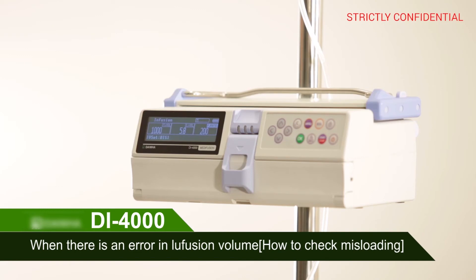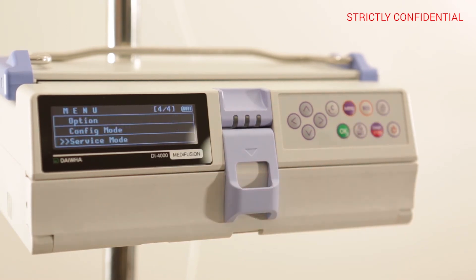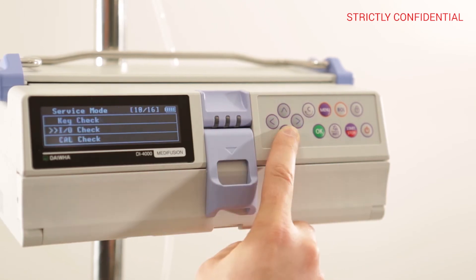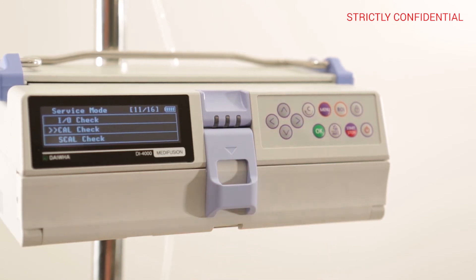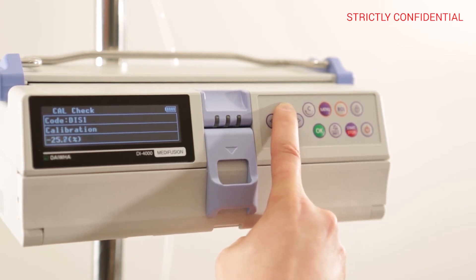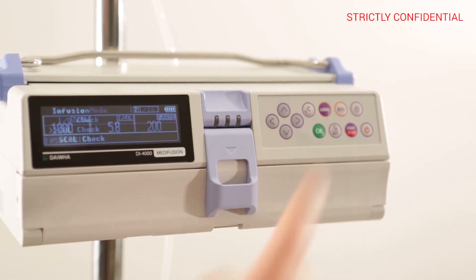When there is an error in infusion volume, press the menu button to enter service mode, enter 1711 as the password, and use the arrow keys to enter the cal check. When an accuracy error occurs, adjust the value using cal check mode. If the infusion volume is over, the value should be lowered. Press OK to return to the initial screen and test infusion volume accuracy again.